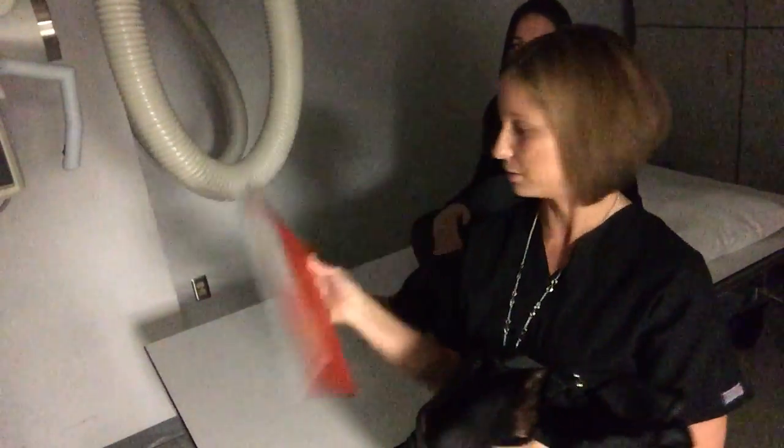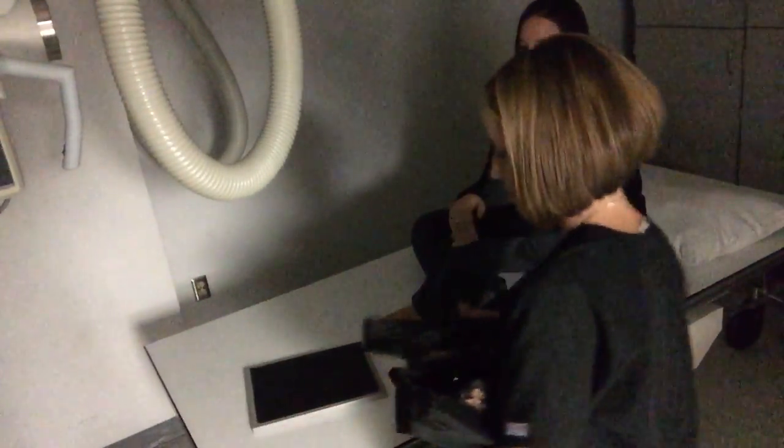She's going to swing her foot up in the direction of my imaging plate. For the toes, those are small, so we're using the smallest cassette we can find, which at this point is an internal cassette.